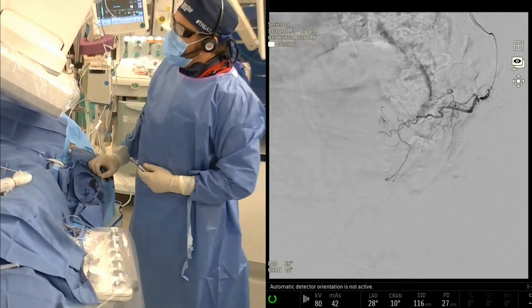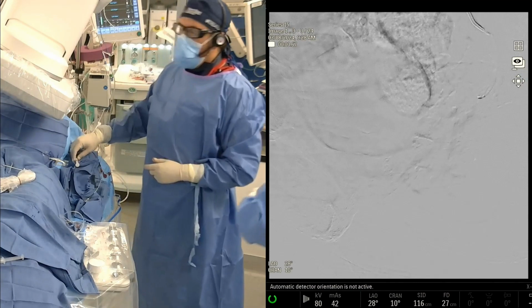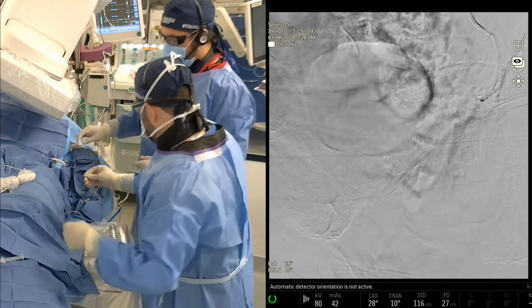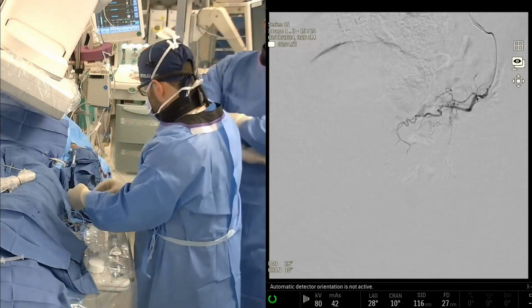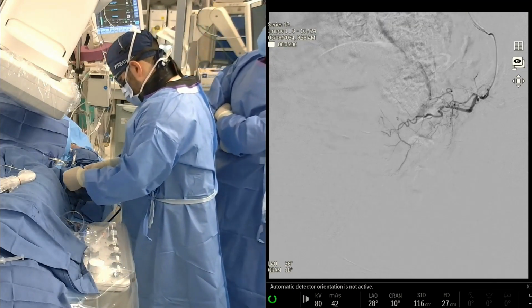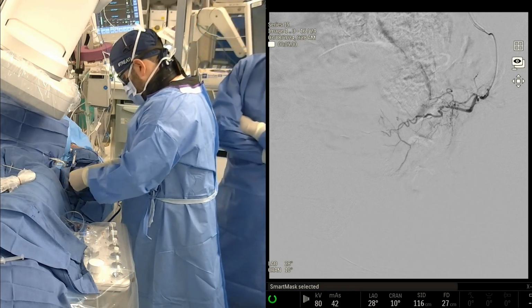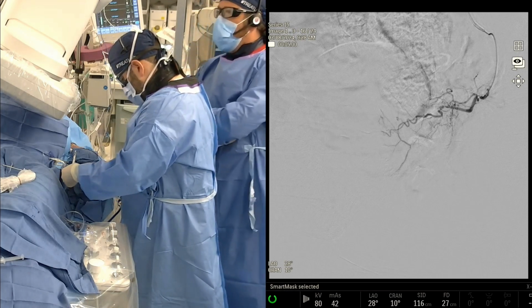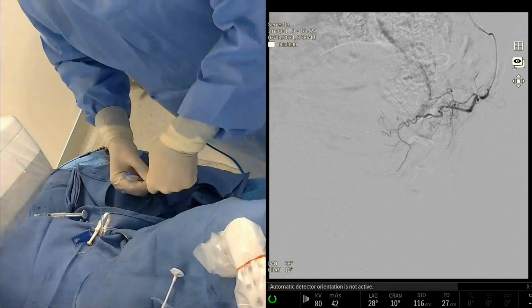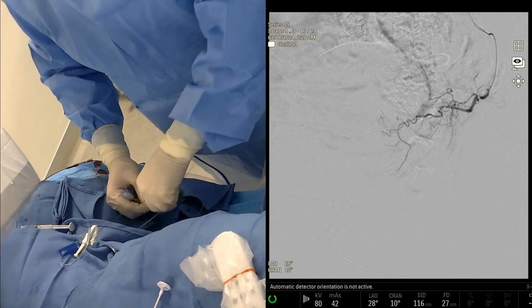Were you originally using cone beam CT in these scenarios? Well, cone beam CT is really used, I think, for three scenarios. You could put that up, Debbie, as a roadmap. Number one, looking for the prostate artery using embolization guidance or something along those lines. So that's one. The second reason is potentially to look for collaterals and other feeders.